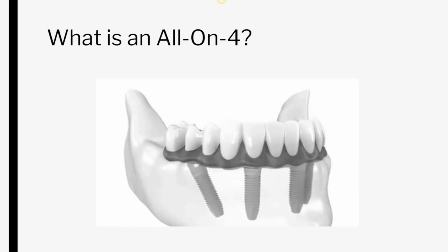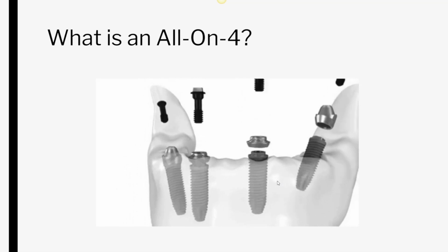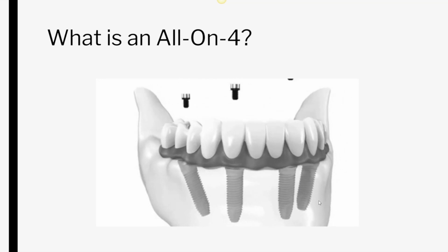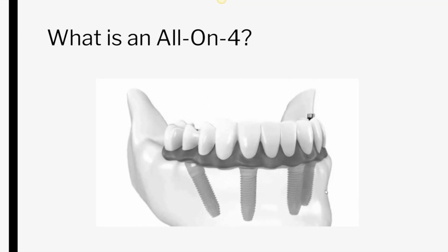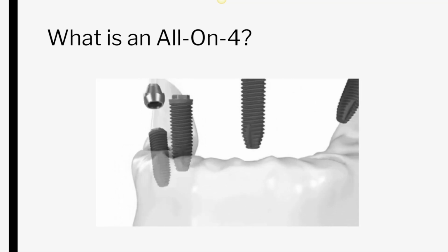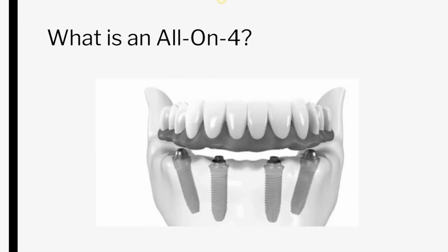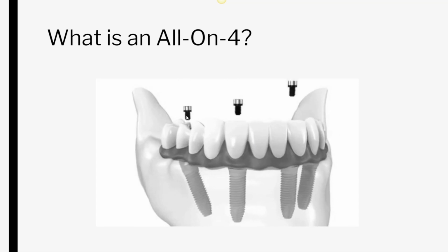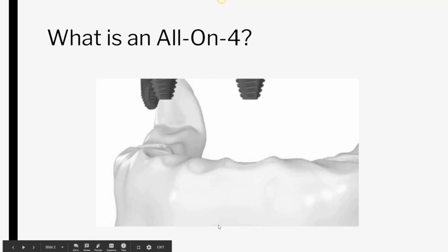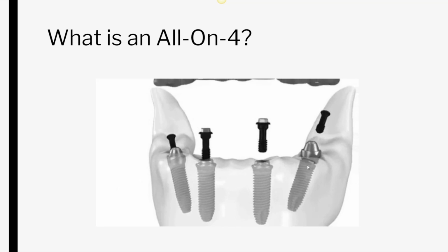Just to explain what an all-on-4 really is, essentially what we're doing, instead of placing a lot of individual implants inside your jaws to be able to chew, function and smile again, is that the all-on-4 concept is a much more efficient, affordable way to replace all your missing teeth with 4 dental implants, then putting this prosthesis on top and screwing it in place. That essentially is what we call an all-on-4. And again, when we look at the all-on-4, we're placing these 4 dental implants in your jaw.